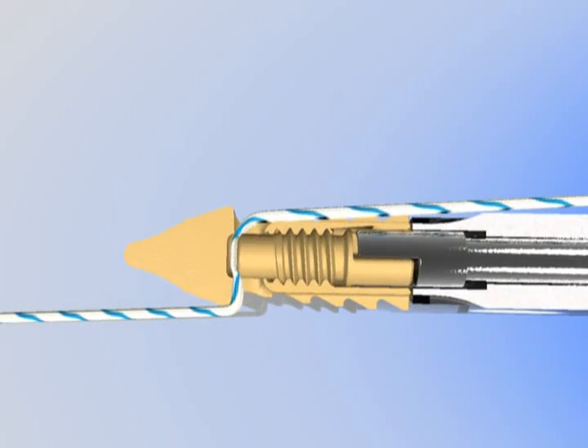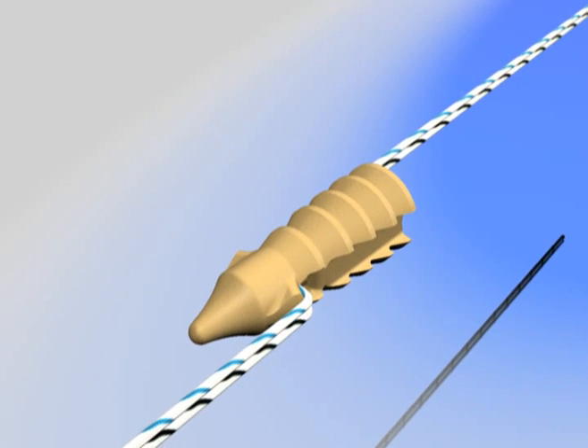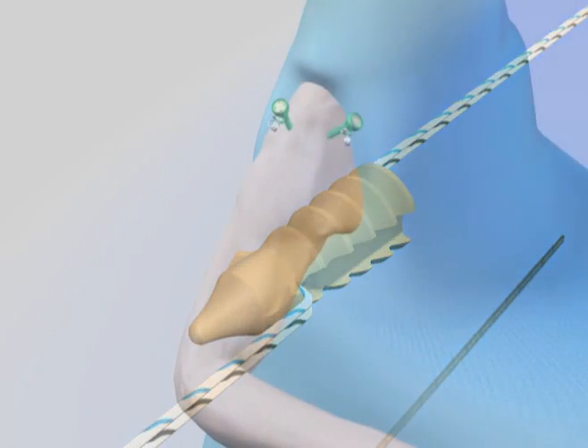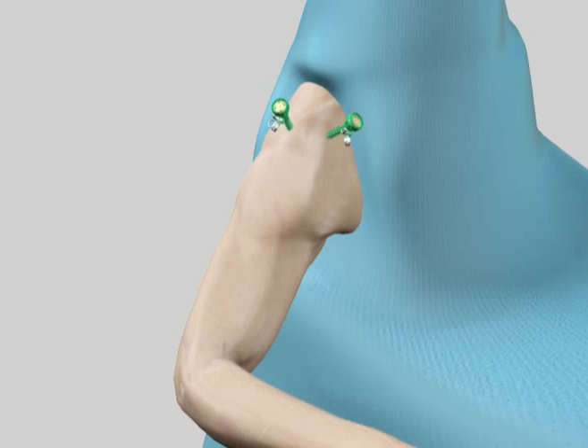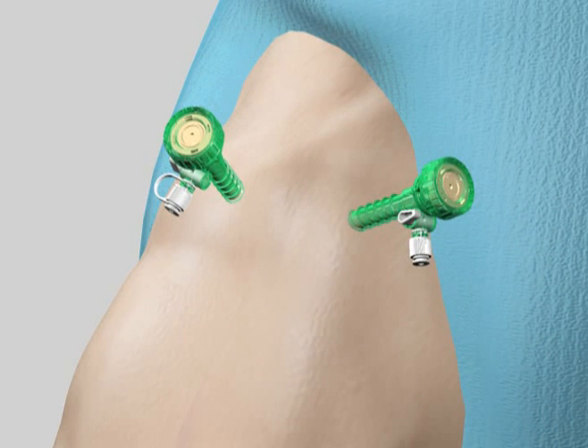If desired, the amount of suture tension can be adjusted and this capability will be demonstrated in the following technique. In our animation, the patient is shown in a beach chair position and the viewing portal is placed in the posterior position. Two standard portal placements are shown in the lateral and accessory lateral positions.